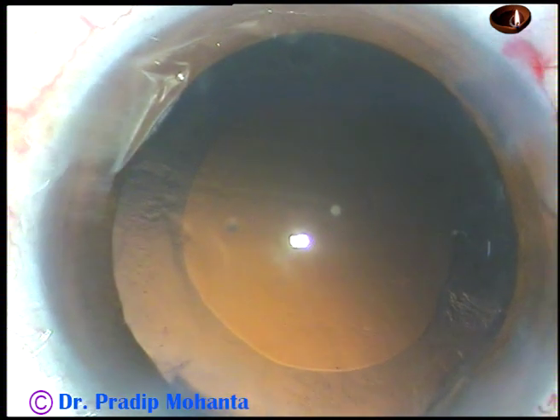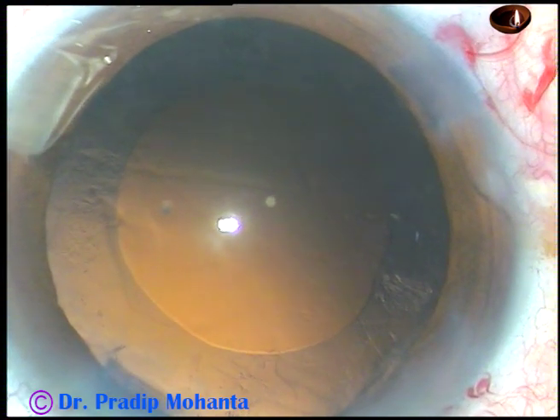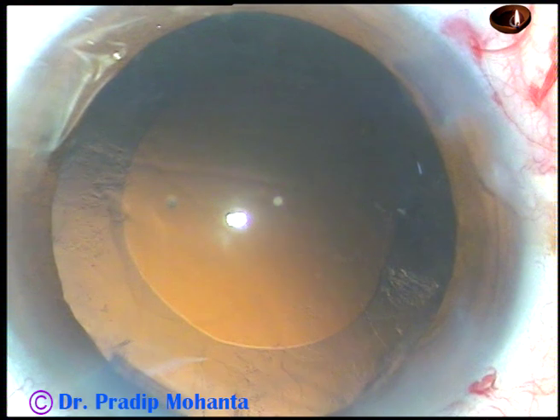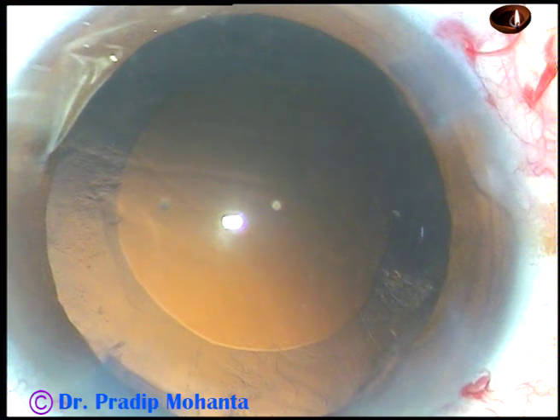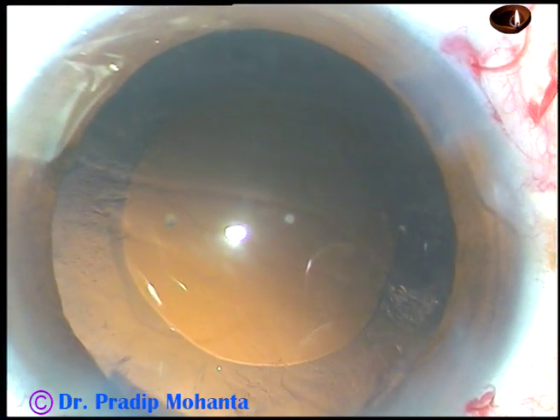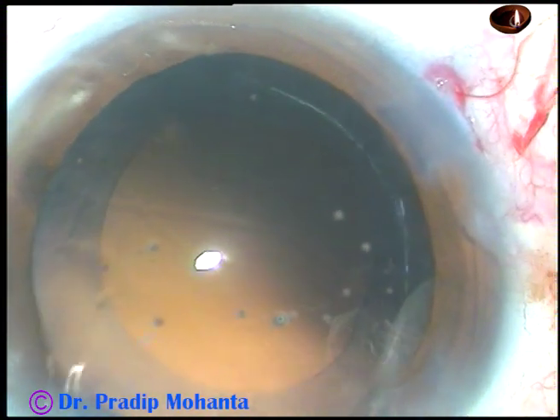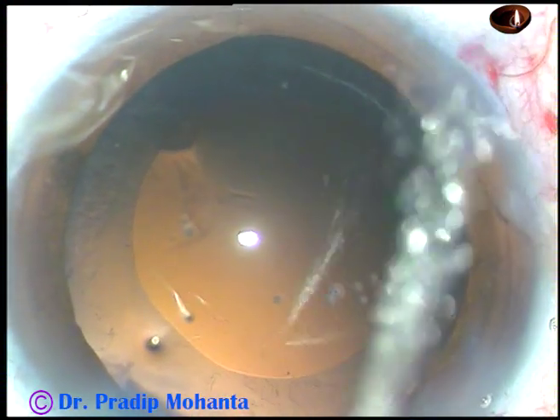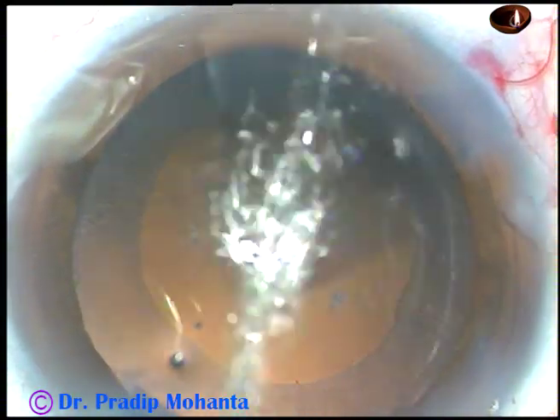Cortical cleanup is done nicely. Only a small speck of cortex is there at 10 o'clock. In this case we have selected a Tecnis single piece intraocular lens. It is a quite thick lens and I am using a B cartridge. So I am enlarging the main incision just by a little bit, say by 0.1 millimeter.